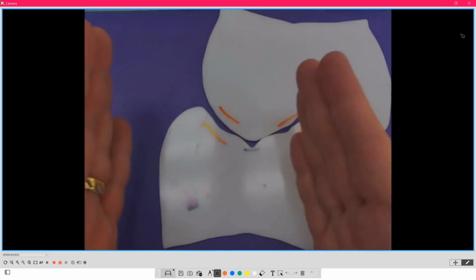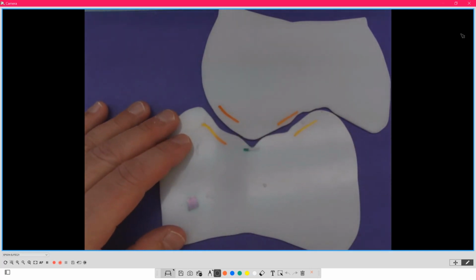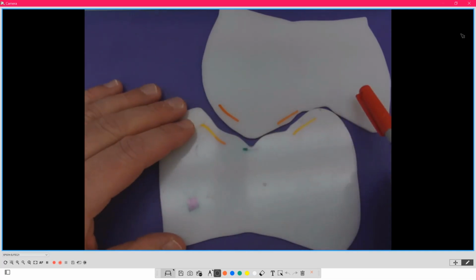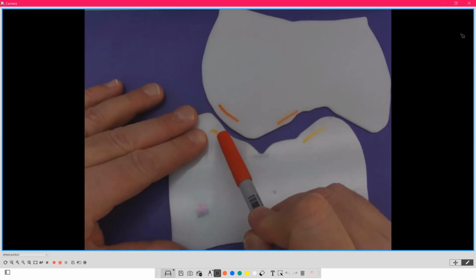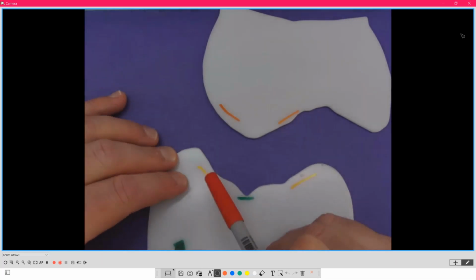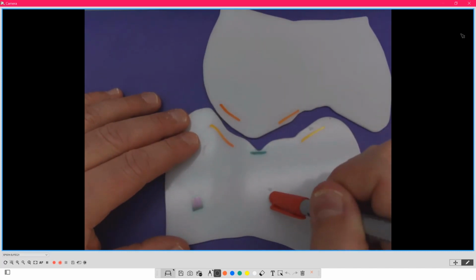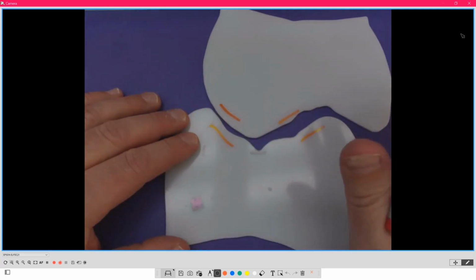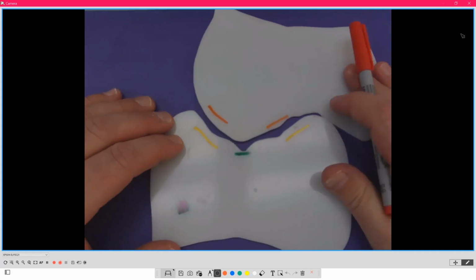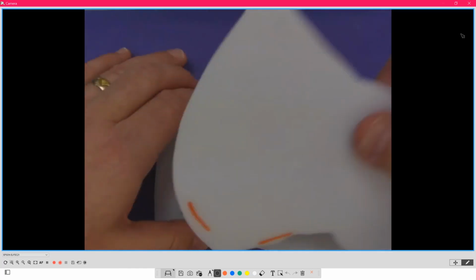So we have freedom. Then we watch our guiding planes. And in the good old days, we were taught that there should be contact, buccal upper, lingual lower. And now I'm saying, no, you don't want that. On these teeth, you want the buccal upper and lingual lower to have no contact so it doesn't hit and slide. This isn't a milling tooth. This is a crushing mortar and pestle tooth, and it's far more effective. I have wiped out the entire complaint of I can't eat lettuce because it's getting crushed. So this is the first thing I wanted to show you, about the guiding planes, the freedom. Okay. Second thing.